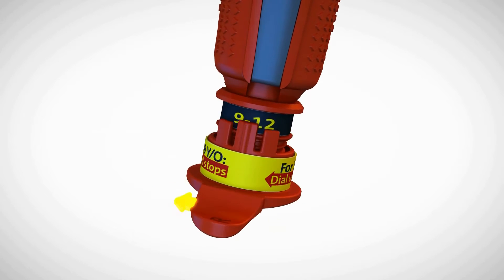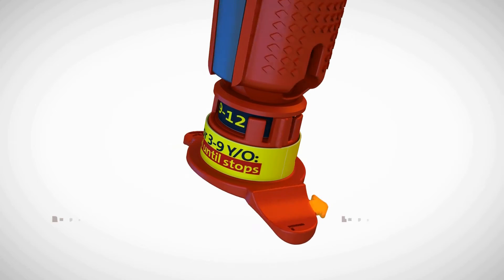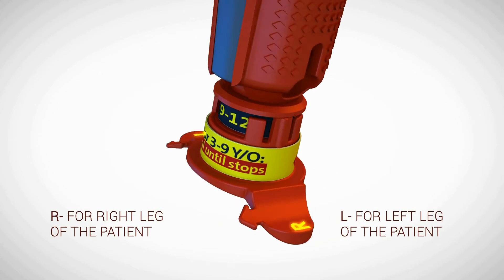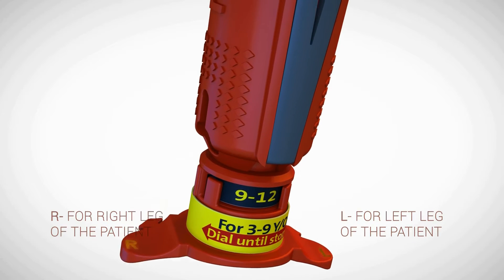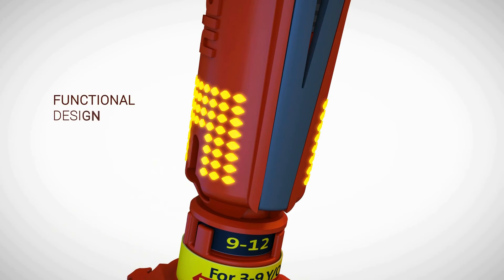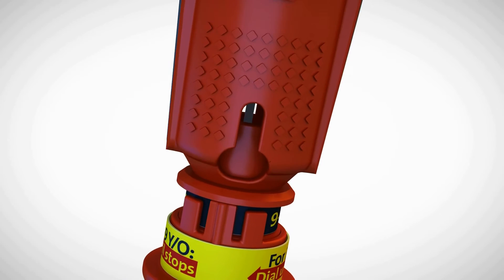The device features location arrows for easy insertion site identification. On the location arrows, the letters R and L indicate the leg of choice for the procedure. The textured dots on both sides of the NeoP ensure the provider maintains a secure grip throughout the I.O. procedure.